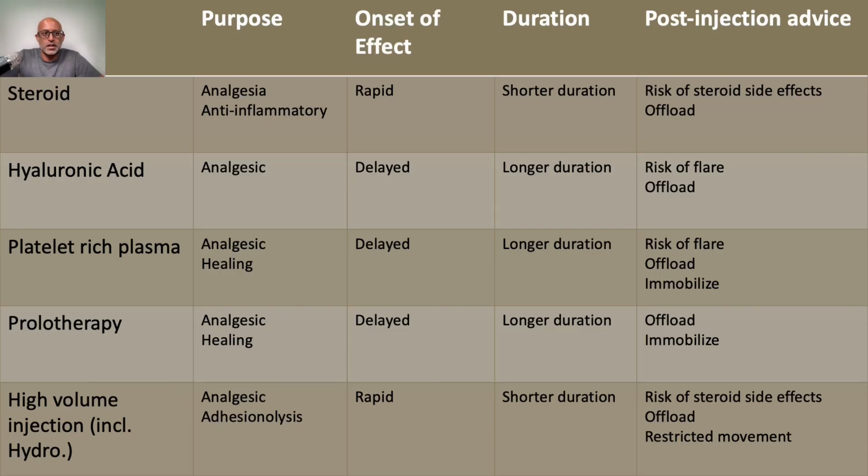Here is a summary slide of the purpose, the typical onset, duration, and post-injection advice that you might give for the different types of intervention that I have mentioned.